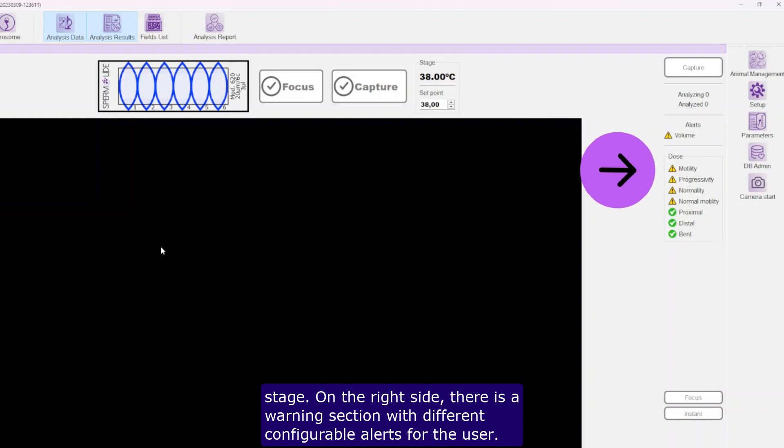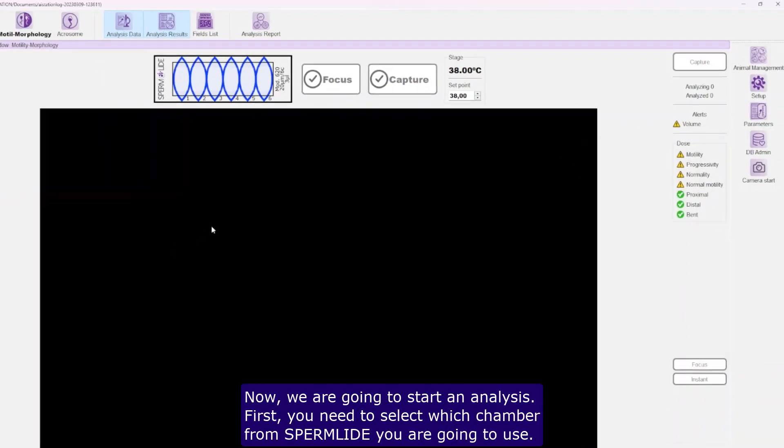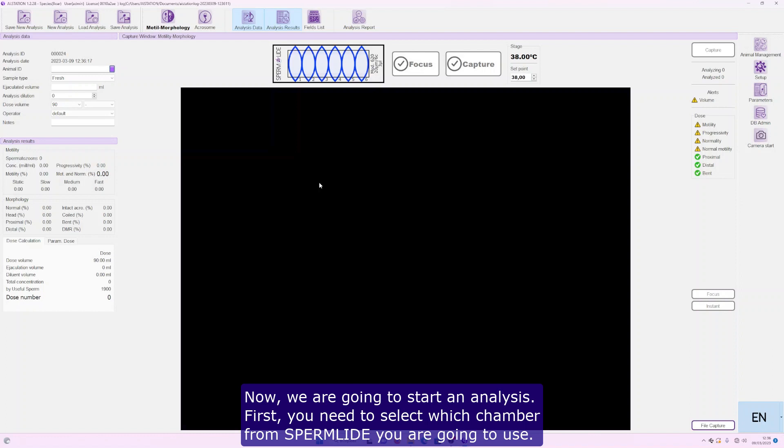On the right side, there is a warning section with different configurable alerts for the user. Now, we are going to start an analysis.